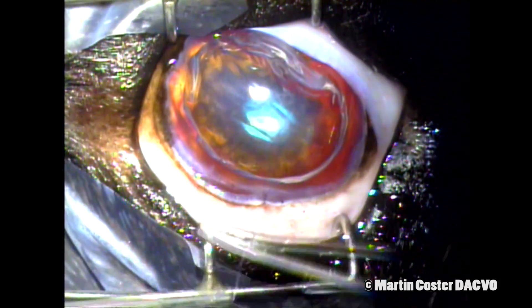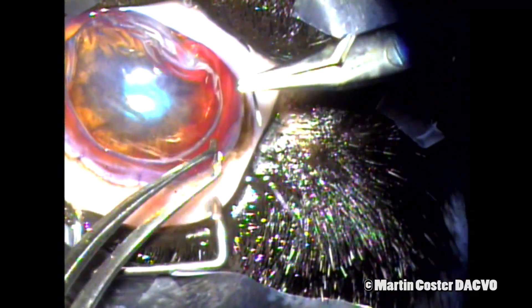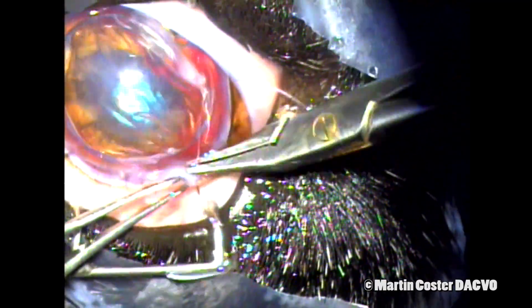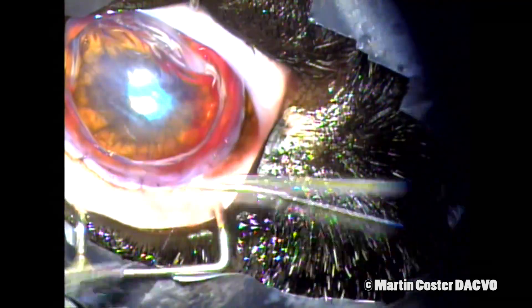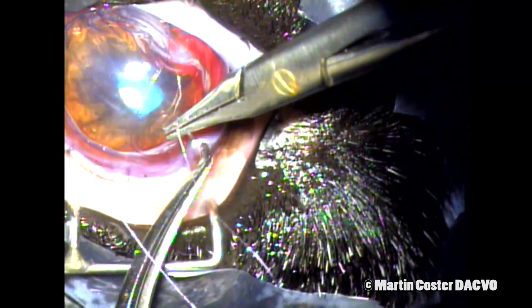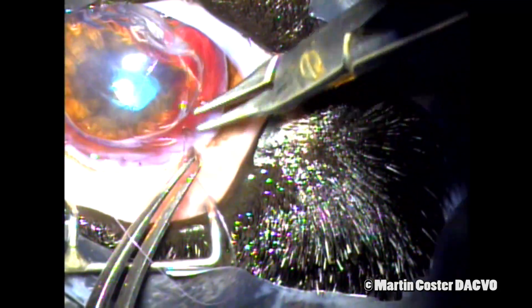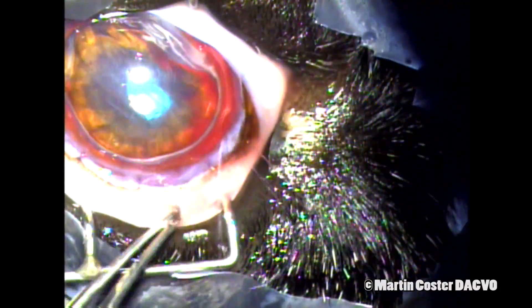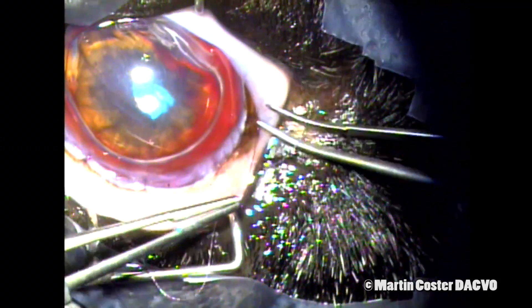I took the opportunity to use this third cardinal suture to complete the corneal closure to the right of the surgical field using a simple continuous pattern. These suture bites are going about three quarters depth into the cornea, not full thickness, and then out through the sclera on the other side. And we tie that knot.